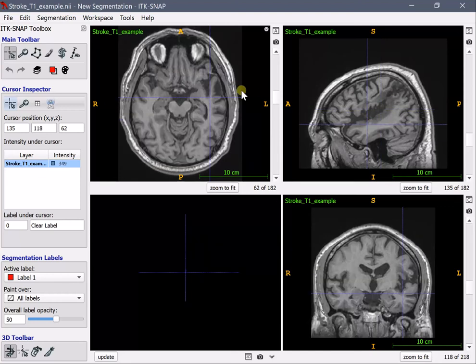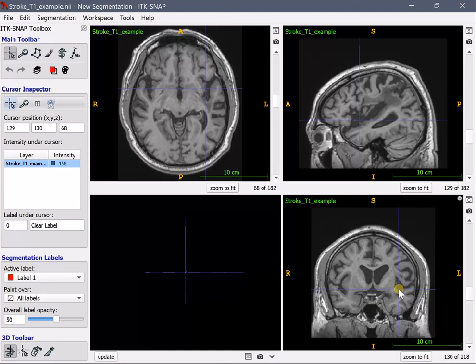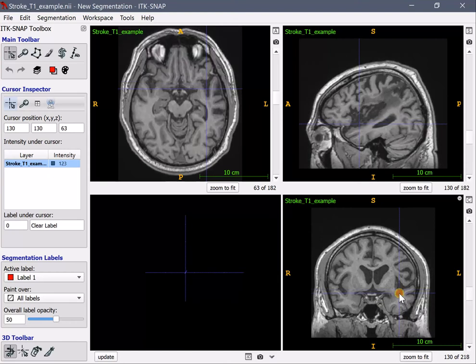You can loop a little bit around to try to understand in particular the difficult parts where you are not yet sure if it's lesion or not. For example here it's a bit unclear to me whether it's lesion or not.